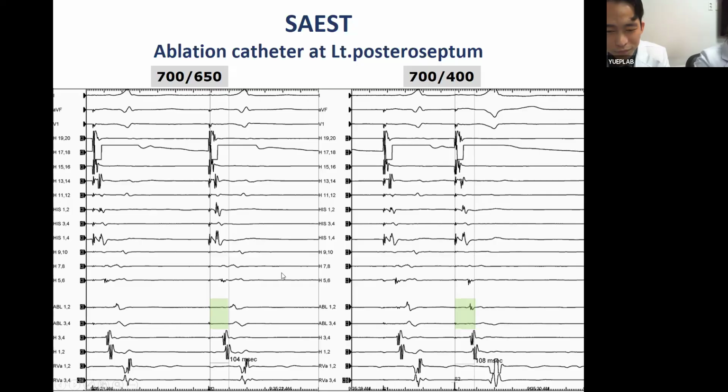And I'm just going to tell you a story about the Mahaim. The reports of left-sided Mahaim cases are from China, published in Frontiers in Medicine, okay? That paper, if you read it carefully, did compare right-sided and left-sided Mahaim cases. And if you look at the AVL tracing of the Mahaim, left and right side, both are negative. That paper has got to be wrong. Something fishy about that paper.